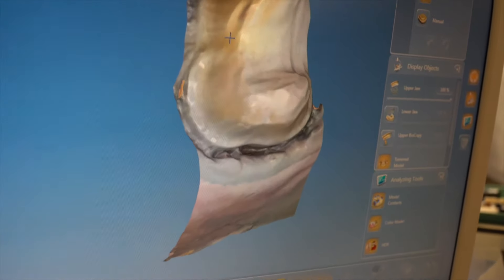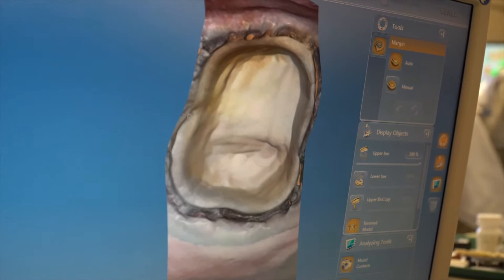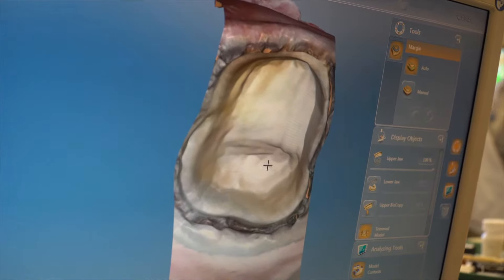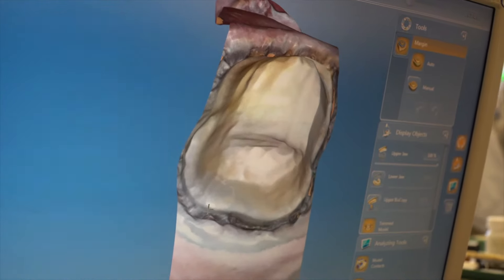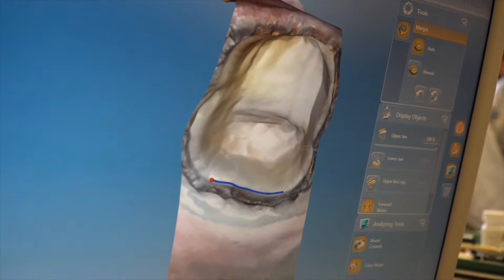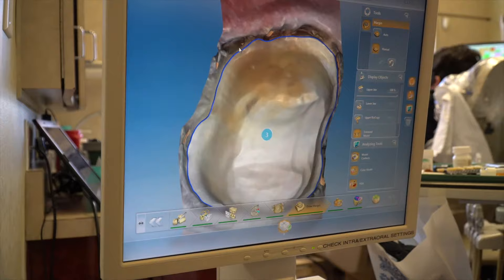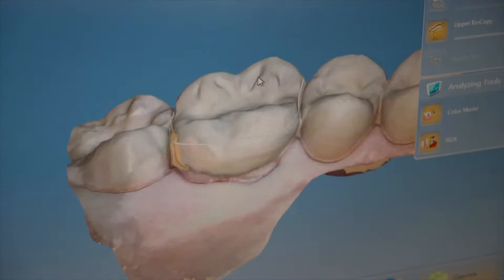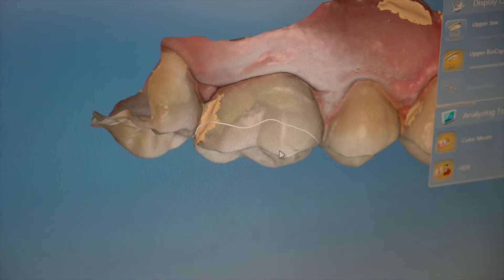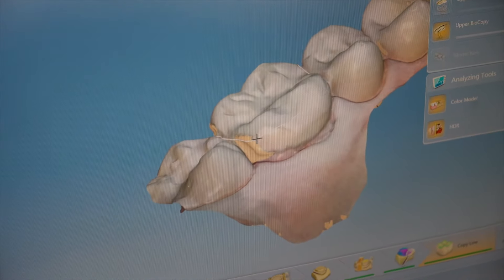If you don't clean up the gums, use a laser, use good retraction, you won't get a good image of the tooth — and there's no way you're going to get a nice-fitting crown, whether you're doing it using CAD/CAM or whether you send it to a lab. This is the crown from before. We took an image of the tooth before we removed the crown. We pretty much liked the way the crown looked — the problem was at the margins of it. So we're going to tell the computer to replicate that design.